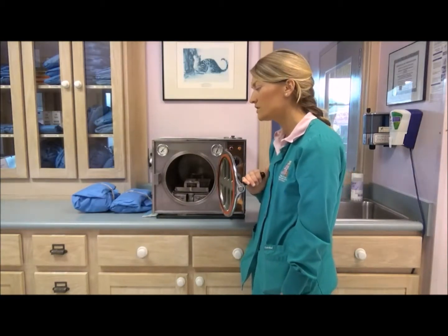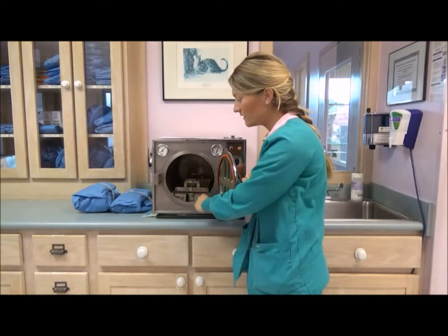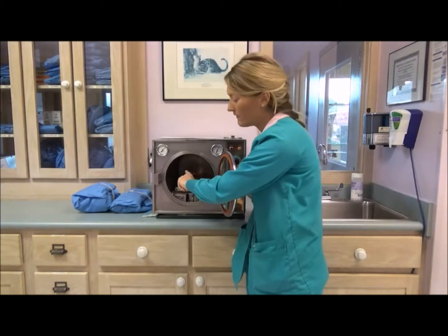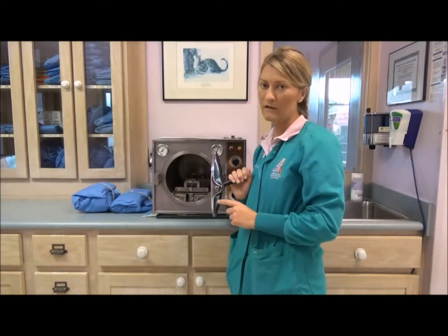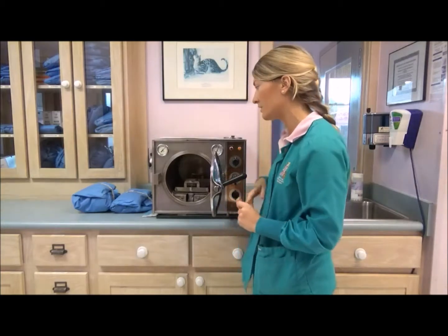Proper loading of the machine, that means that you don't want to overload the machine. So when you fill items in that chamber, they should never be packed so full that they touch the inner chamber. And then proper operation, you just want to make sure that you follow all the steps properly and that the machine reaches the appropriate temperature and pressure.